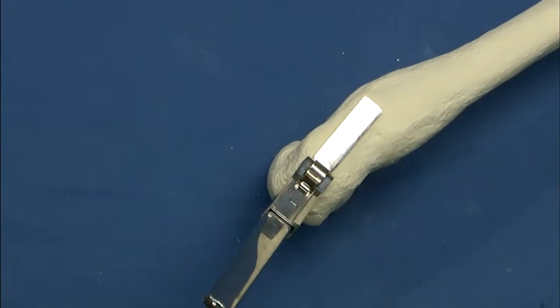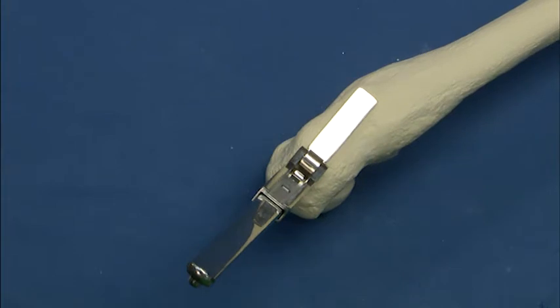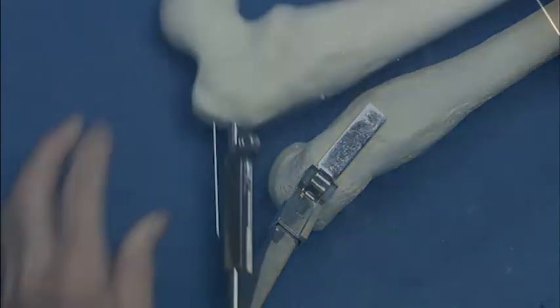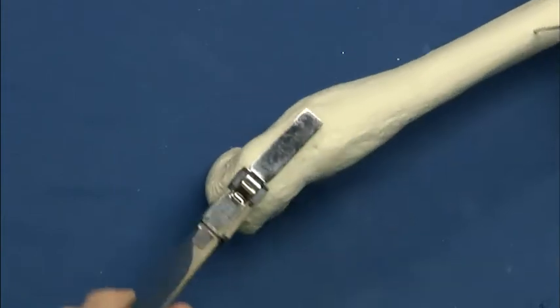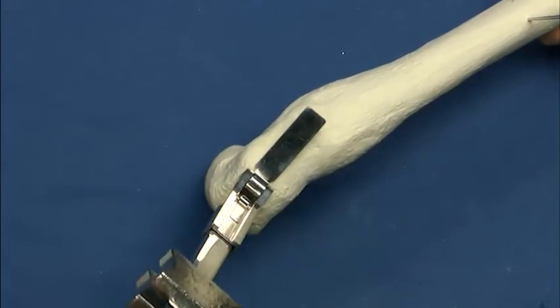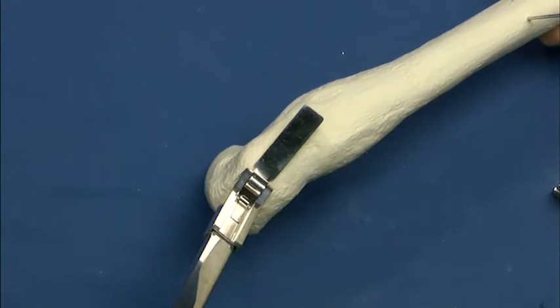Typically, if we're going to use a 60-millimeter blade today, you'd over-insert the seating chisels by about 1 centimeter, so you have plenty of room, and you'd go in and out multiple times, so you have a very well-worn path for the blade. If we look at where this is on this plane here, the last thing you'd always do before you go anywhere else is loosen the seating chisel. In young hard bone, if you do this after you've done your osteotomy, you get to close the wound around the seating chisel because it won't come out.